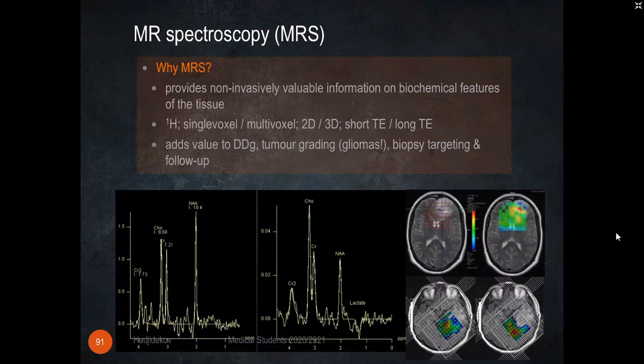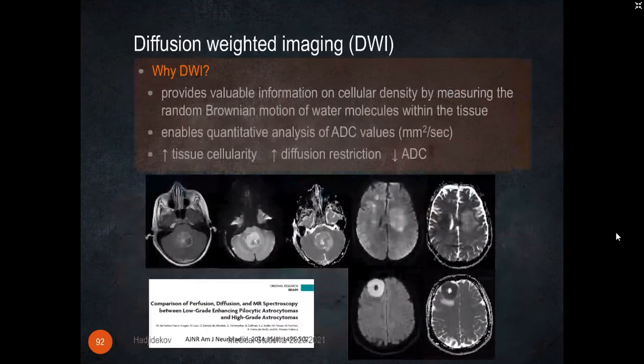And we are using single voxel spectroscopy or multivoxel spectroscopy, and this can add some value to the differential diagnosis and most importantly to the tumor grading, and it's important also for biopsy targeting and for follow-up of the lesions.